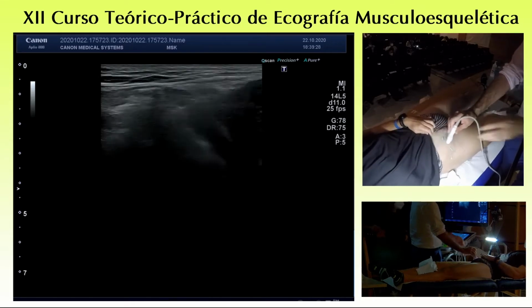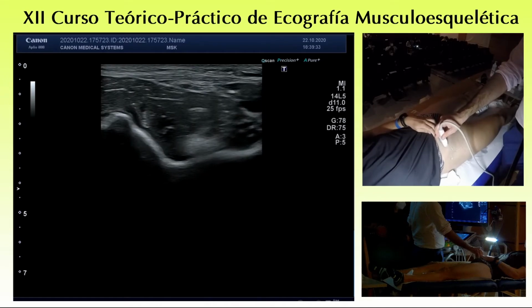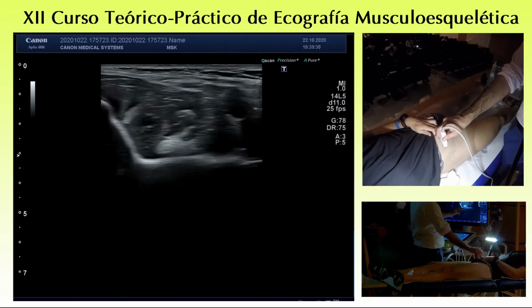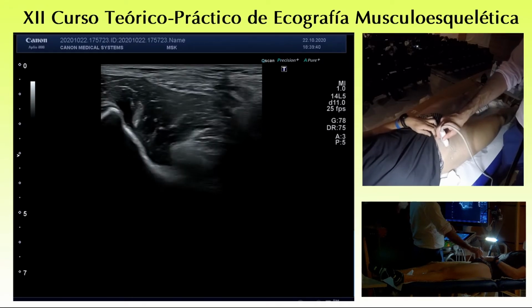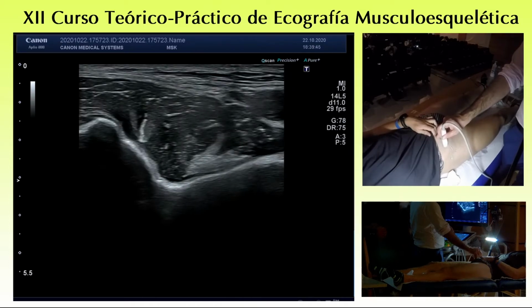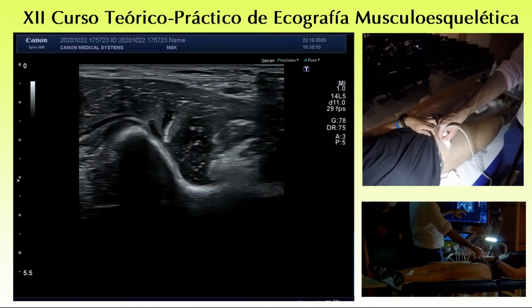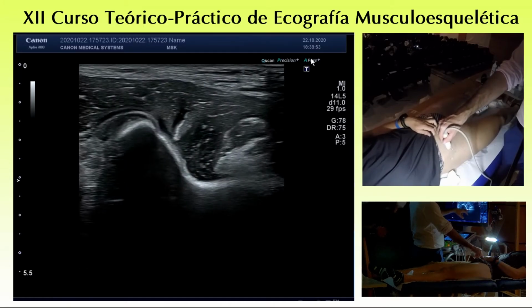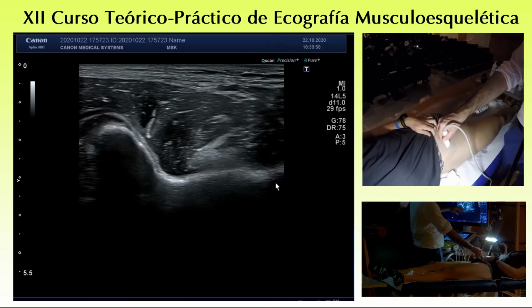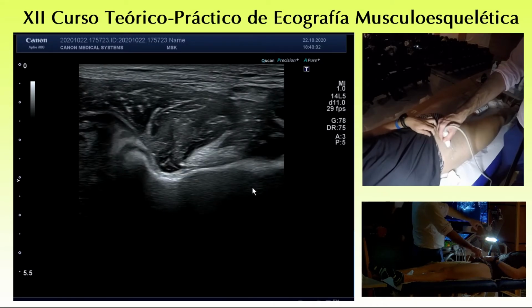First landmark, with the probe in the right position. Okay. So, for instance, it's very important that you keep this angle, that orientation, because in a different orientation it becomes more difficult. The starting point is that you have to place the pubic ramus exactly here, exactly flat, parallel to the lower part of the screen.